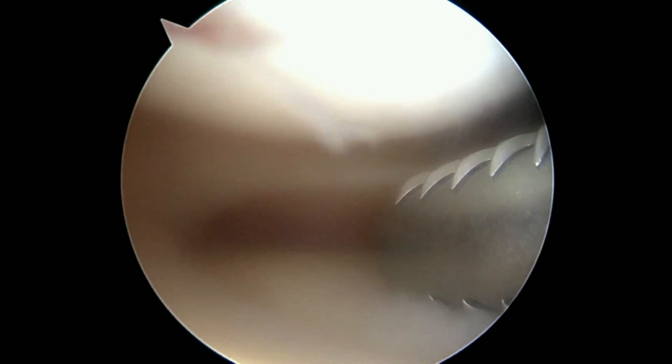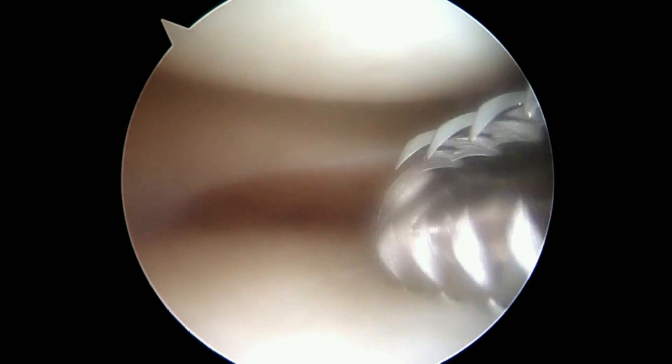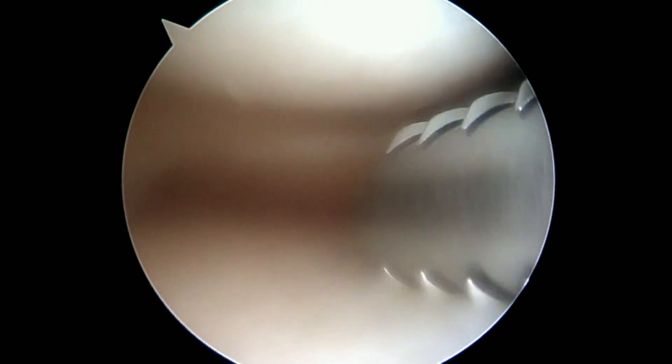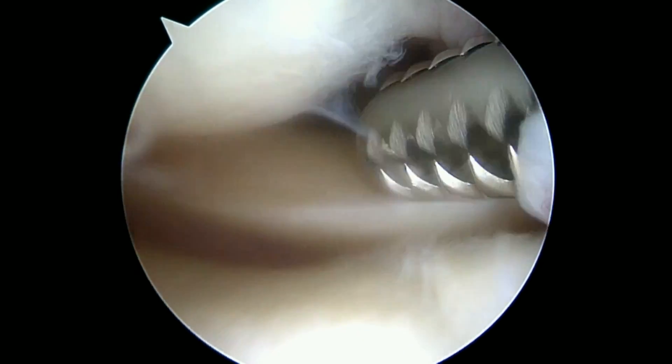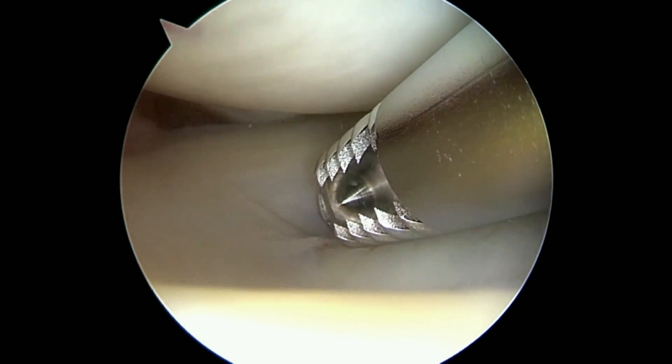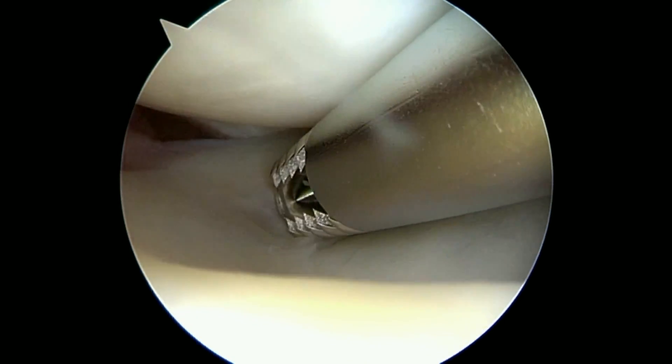So now that's gone. That's the one piece we saw earlier. We're going to continue to look around and see if we see any more. Back there on the left is your popliteus tendon in the back.